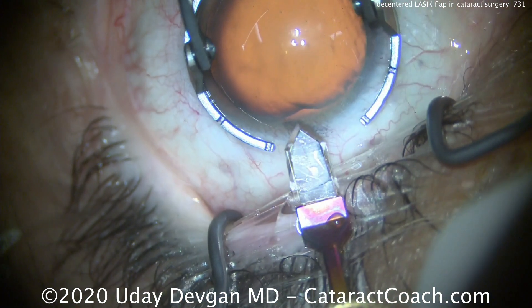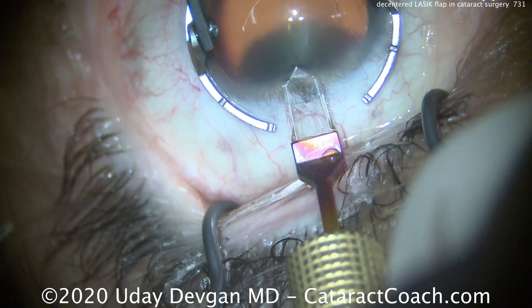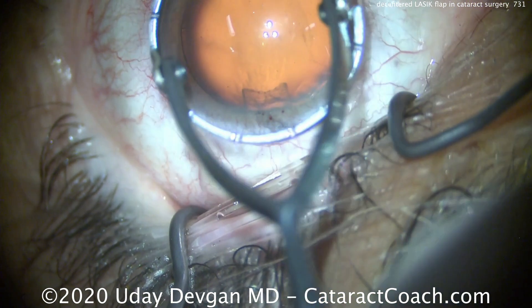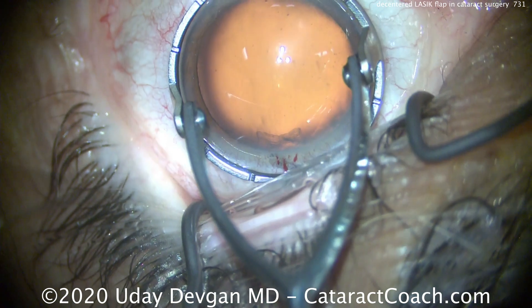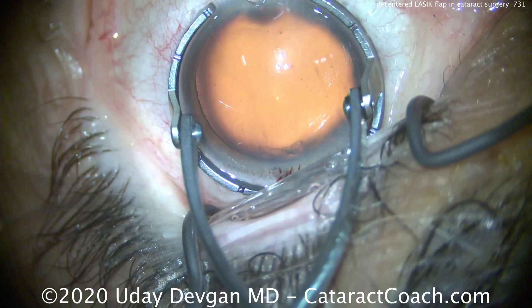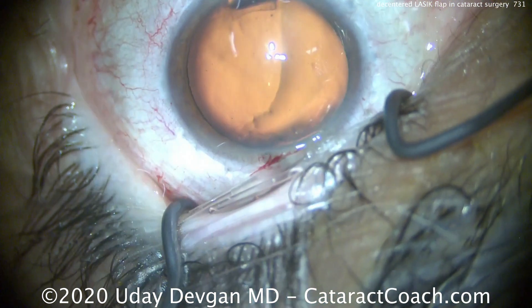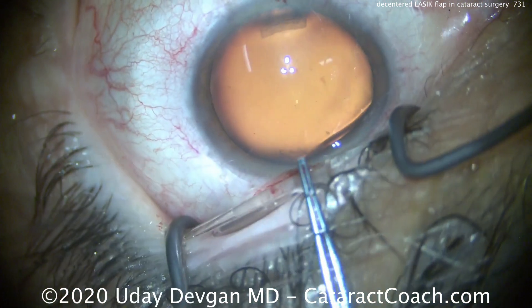We're going to line that up — there's the diamond, it's about 2.75 millimeters wide. And as we make this, we make it right on that steep meridian. Good tunnel length, good architecture — that'll help a little bit with the astigmatism. And now what we're going to do is make an opposite corneal incision. We're going to pull the eye down a little bit. Using the same technique and making the same type of incision — another full thickness, full width phaco incision, just opposite it. And I think this is going to help us reduce his astigmatism to an acceptable level.